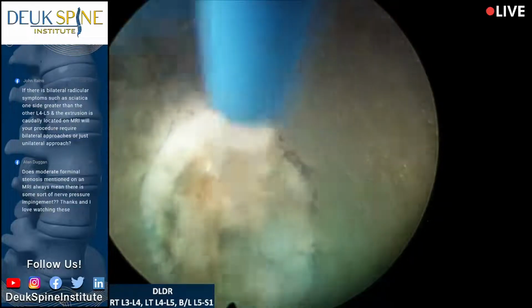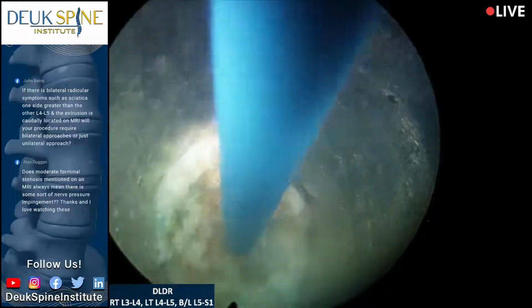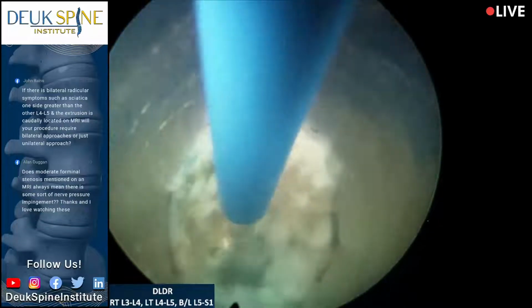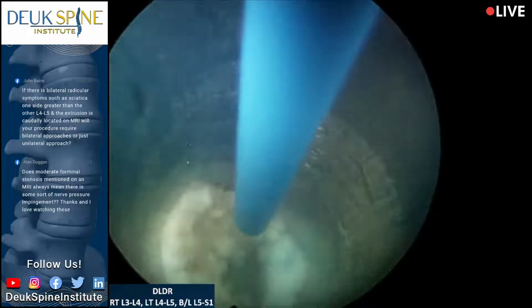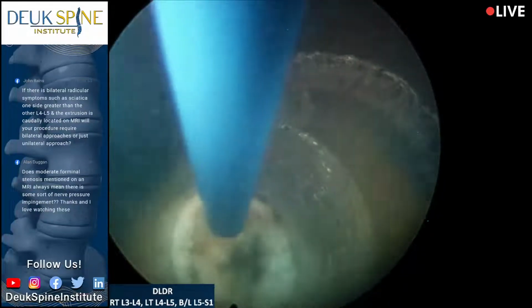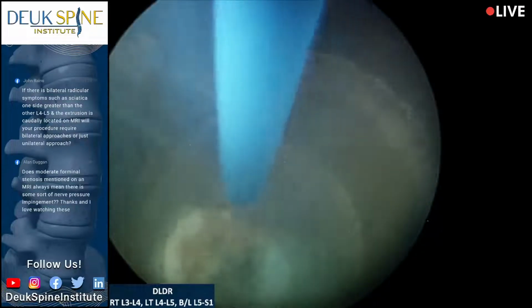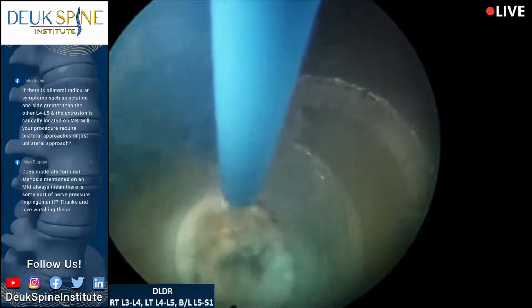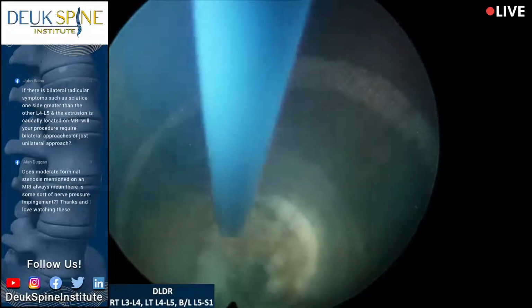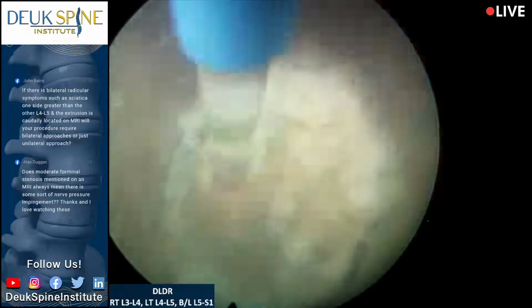And it's probably the most expensive washing machine you've ever thought of because it costs over $100,000 for one of those things. They're very expensive. But not as expensive as our fluoro machine, right? Which costs twice as much almost. So, long story short, I'm just pointing out that this surgery requires about $1 million worth of equipment to perform, and the laser itself is a holmium YAG laser, medical grade.